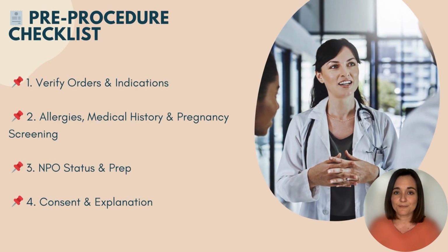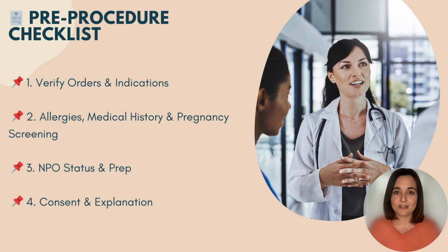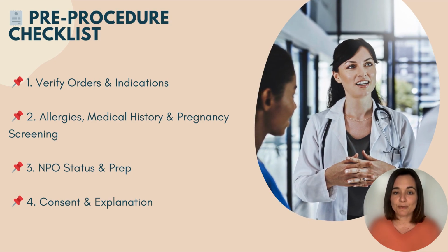Pre-procedure checklist. Verify orders and indications. Confirm the correct procedure with the referring physician's note. What are we looking for? Dysphagia, reflux, obstruction? You want to walk into the room knowing what question you're answering. Second up, allergies, medical history and pregnancy screening. Ask about allergies, especially to iodine, shellfish, or latex. Note chronic conditions like diabetes, renal issues, or recent surgeries. And always ask females of childbearing age if they might be pregnant.